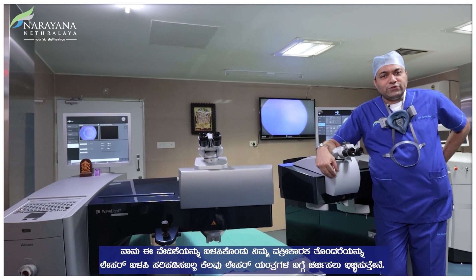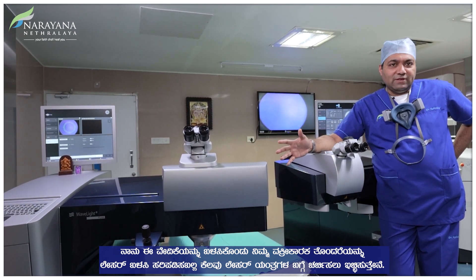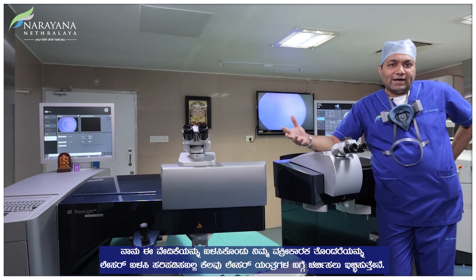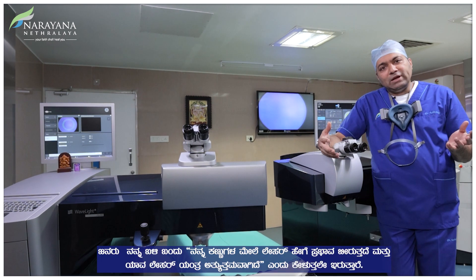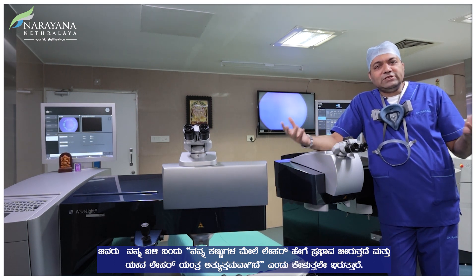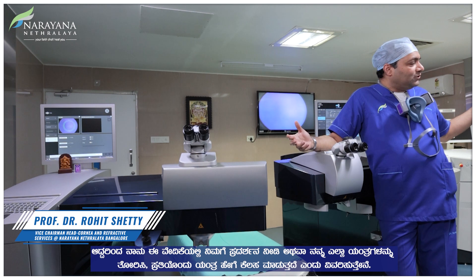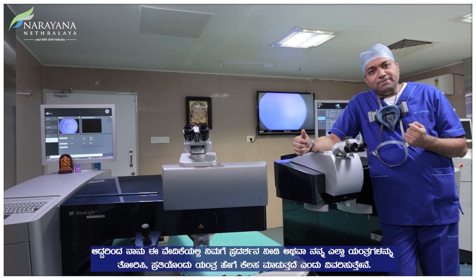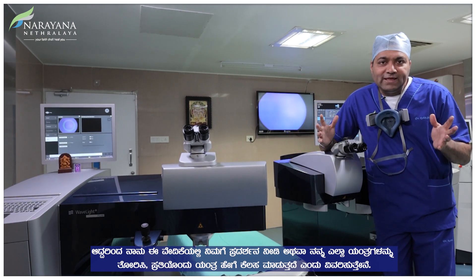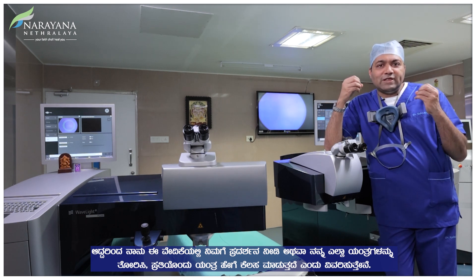I want to use this platform to discuss some aspects of the laser machines which are useful for correcting your refractive error. I have people coming to me asking how does laser affect my eyes and which laser machine is the best. So I would like to demonstrate and show you my machines and tell you how each machine works. I'm not going to go into the theory of these technologies but into the finer aspects of what these machines actually do.